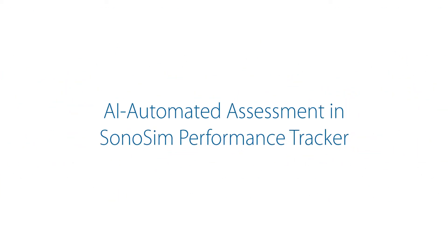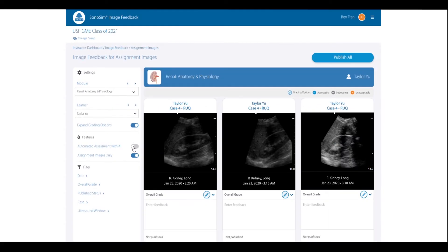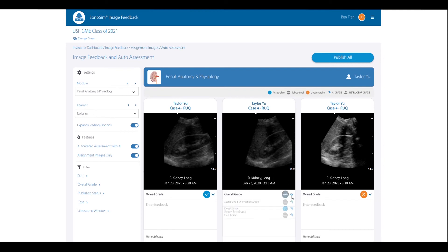To save valuable instructor time, the launch of Automated Assessment will assist with grading learner images through artificial intelligence. Each image will be graded based on image acquisition orientation, depth, and gain. Automated Assessment serves as a first pass, with the ability for instructors to review and change grades if necessary.